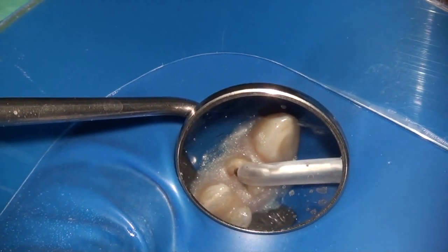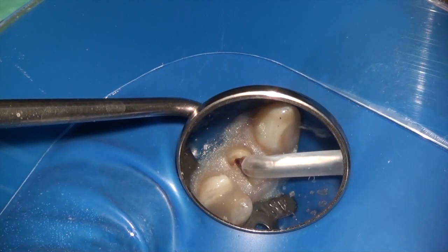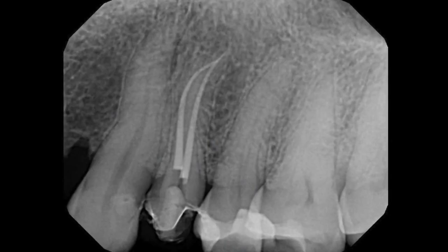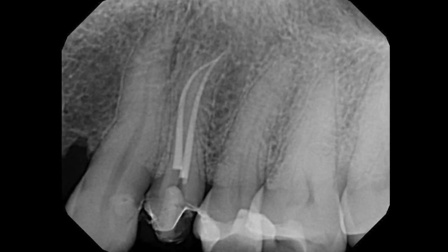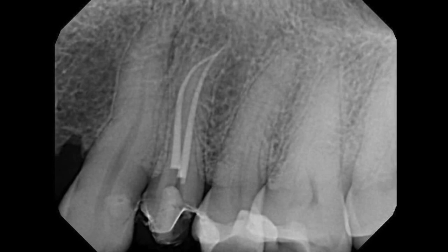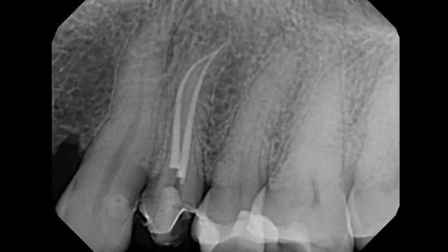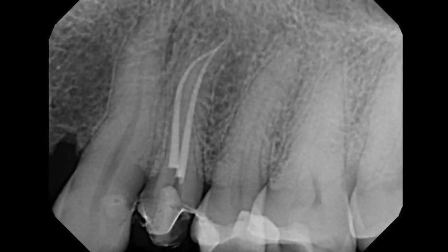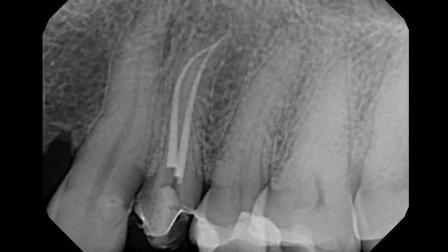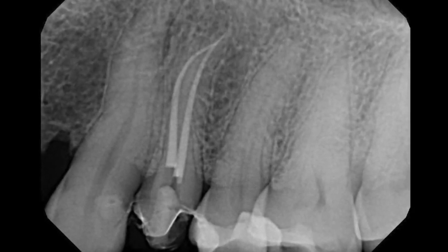In this case, I use the EndoSequence through a cycle of 40 through 20 until my desired length is reached. Here's the final radiograph showing obturation using the EndoSequence system and the bioceramic one-cone obturation system. As you can see, the Scout Race Files did help us reach the apex and follow the curvature gently and safely. The entire case was performed in about 15 minutes including the obturation.